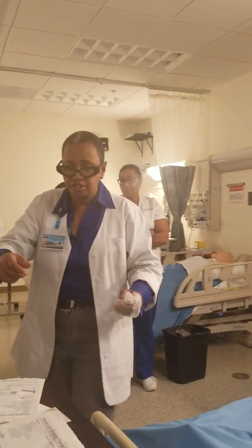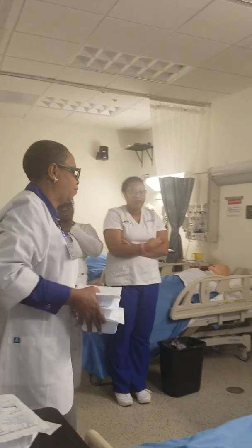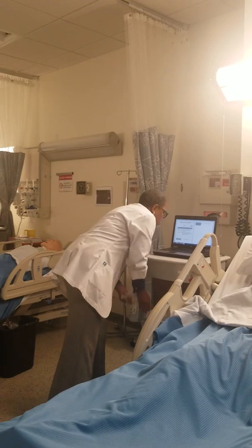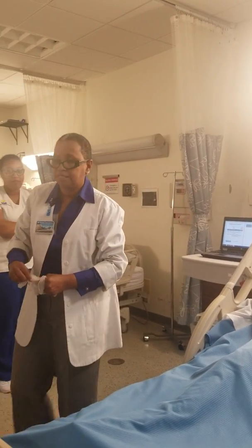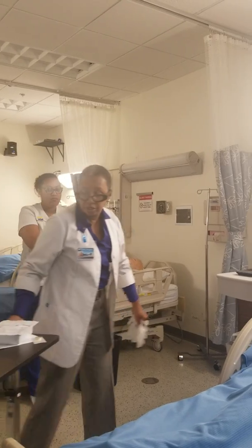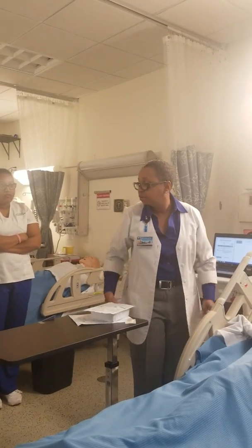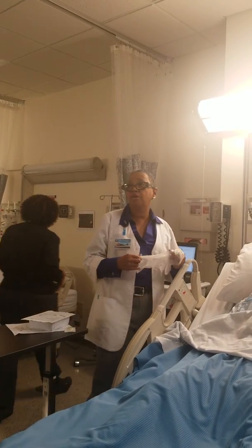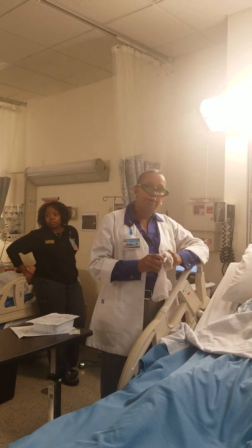So if you've got to do a central line dressing change, and it's day 7, and I've got a protocol that says I need to change it, then I need to change it, okay? So what I need to do is come in, first of all, and assess my patient. Which way do you want this patient facing when you're changing the central line? Facing away. You want his face turned away, and if he can't turn his face away, what do you want to do? Put a mask on. Put a mask on, okay?